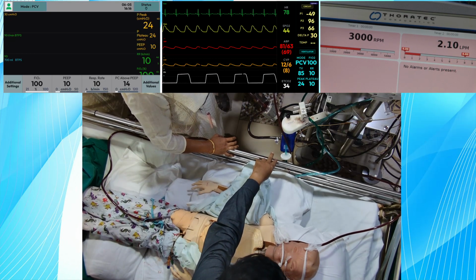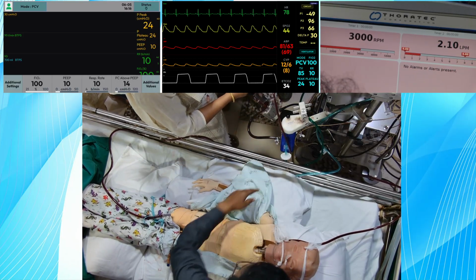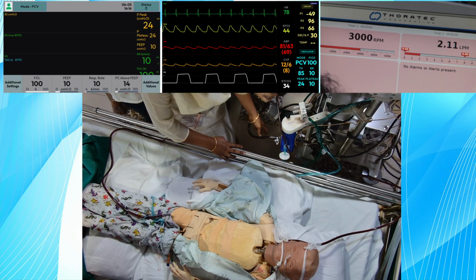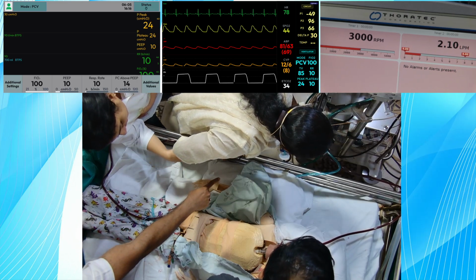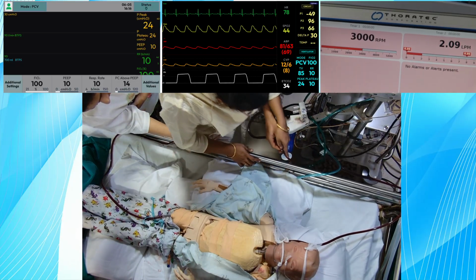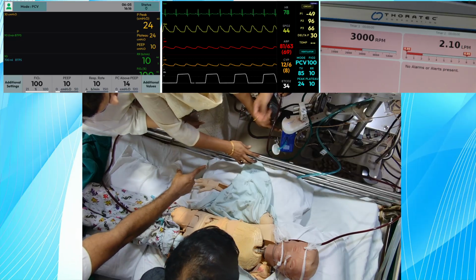Whether the stopcocks are aligned properly and all, so just check the bridge. Is the bridge open? This is not a bridge. This is connected over there. These are all connected to the circuit. This three-way is open, I think. Is there a clamp, right? No, there is a flow sensor. This three-way is open. Should I open the stopcock here? It's open now.